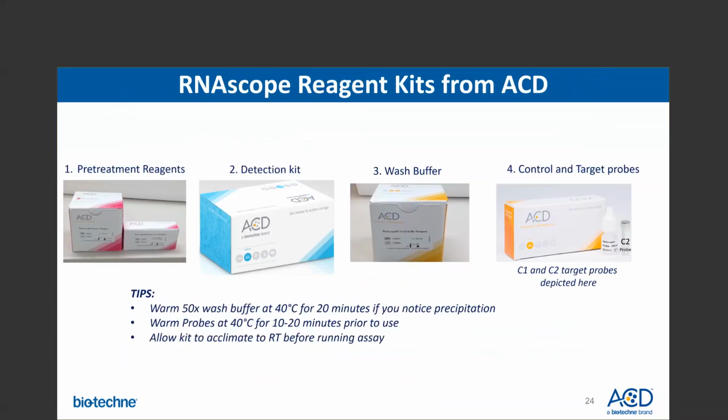Here are snapshots of the reagent kits that you would require from ACD. Shown here are the pre-treatment reagent kits, the detection kits, the wash buffer for washing steps, and then control and target probes, which would be in channel 1 and channel 2.